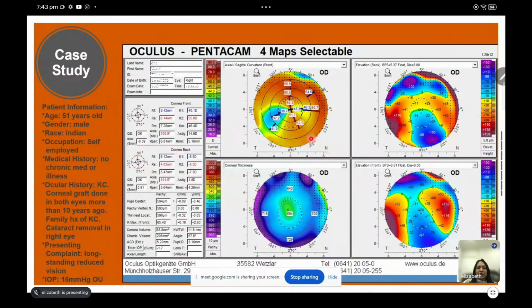So when I talk about VA and vision with my patients, I talk about 6 happy vision. What is going to make my patient happy and functional? What is their job? What do they do day to day and what kind of vision would they need to do their jobs? And you would know that not everybody needs 6/6 to actually function or survive. Some people, 6/12 is actually perfectly fine for them. So you need to find out what are your patient's needs and what are you both working towards. So you all set realistic outcomes before you even start fitting a specialty lens.